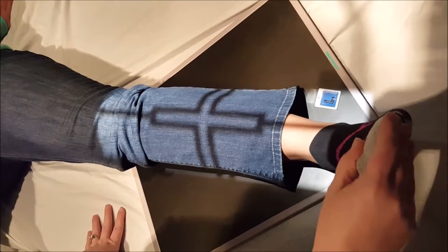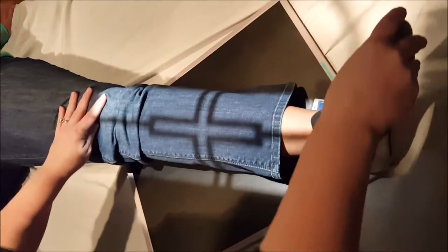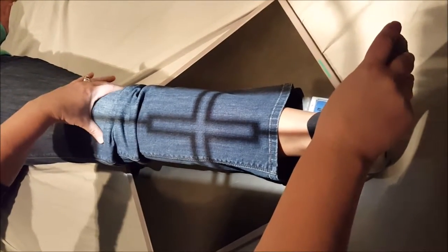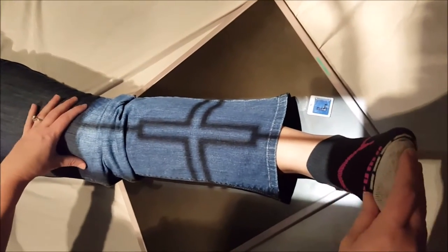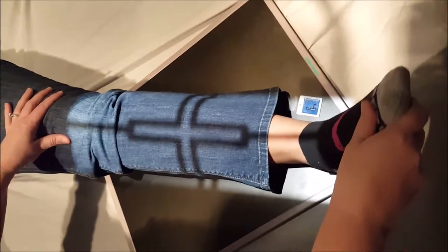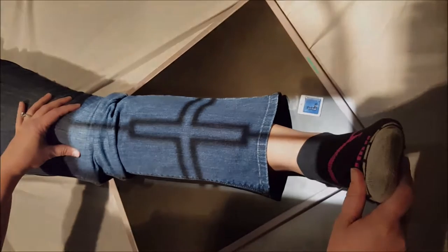So I know I'm not exposing anything needlessly. You do need to have the patient's toes straight up in the air. If you relax them out to the side, the patella will go to that side, and this will not be true AP, neither will the ankle. Most of the time the patient just relaxes out, so you make sure that they're nice and straight.